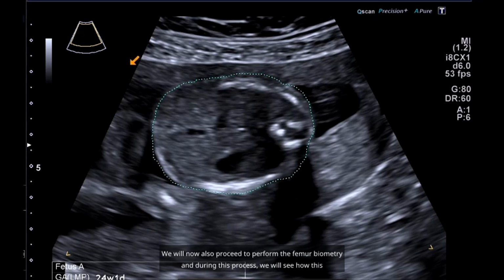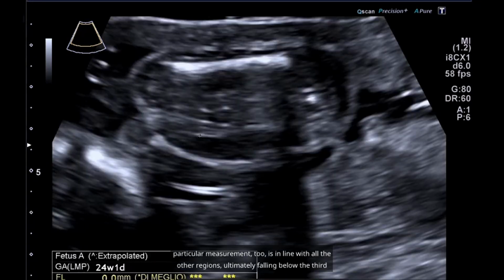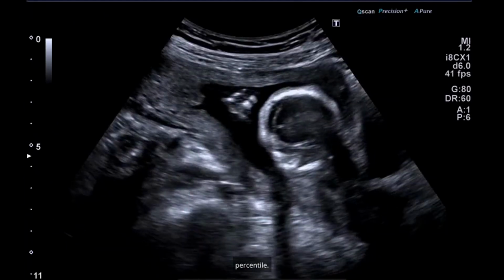We will now also proceed to perform the femur biometry, and during this process, we will see how this particular measurement too is in line with all the other regions, ultimately falling below the 3rd percentile.